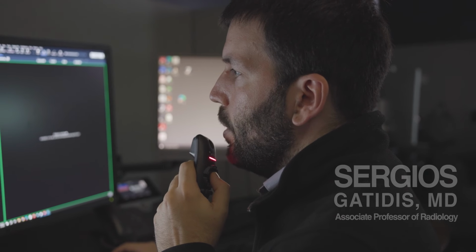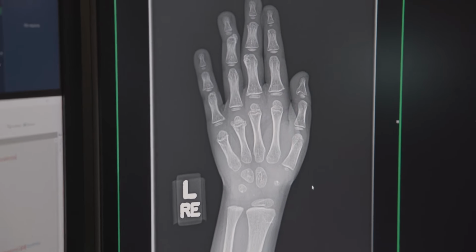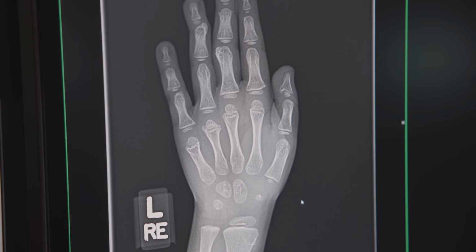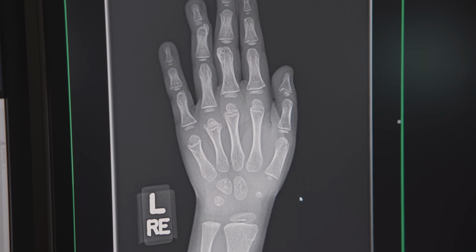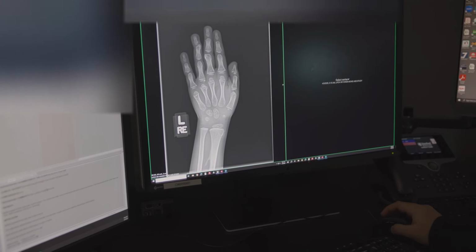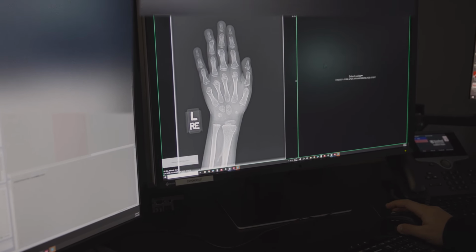Paragraph. Dysplastic appearance of the first distal phalanx base, the fourth middle phalanx head, and the metaphyses of the fourth and fifth metacarpals period.